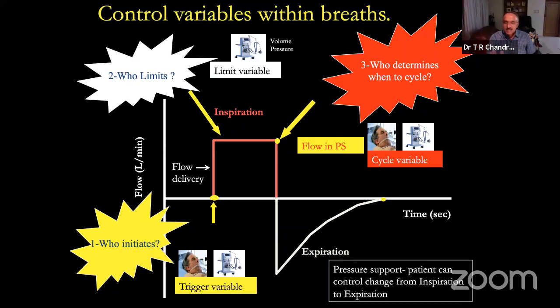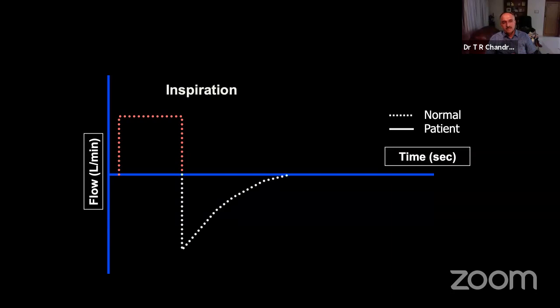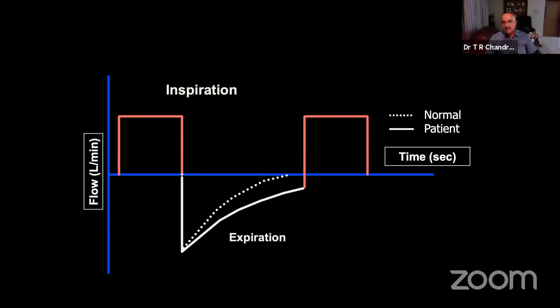This is just to reinforce that by knowing the flow versus time, it gives you a concept to learn the modes. That's what I'm trying to tell you when I'm discussing this with graphics. So it is a flow versus time. Now look at what has happened. Now what has happened? See, let us analyze.